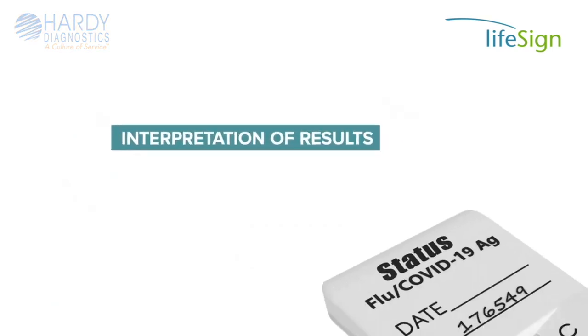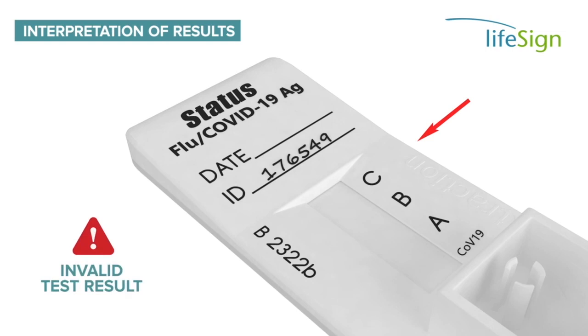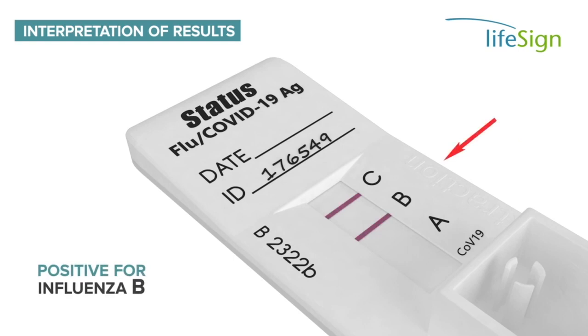For accurate test result interpretation, it is important to refer to the detailed information in the package insert. All valid test results will have a reddish purple line at the control position of the test device. If there is no line at the C position of the test device, the result is invalid. A positive test for influenza A will have a line at the A position. A positive test for influenza B will have a line at the B position. A positive test for COVID-19 will have a line at the COVID-19 position of the test device.